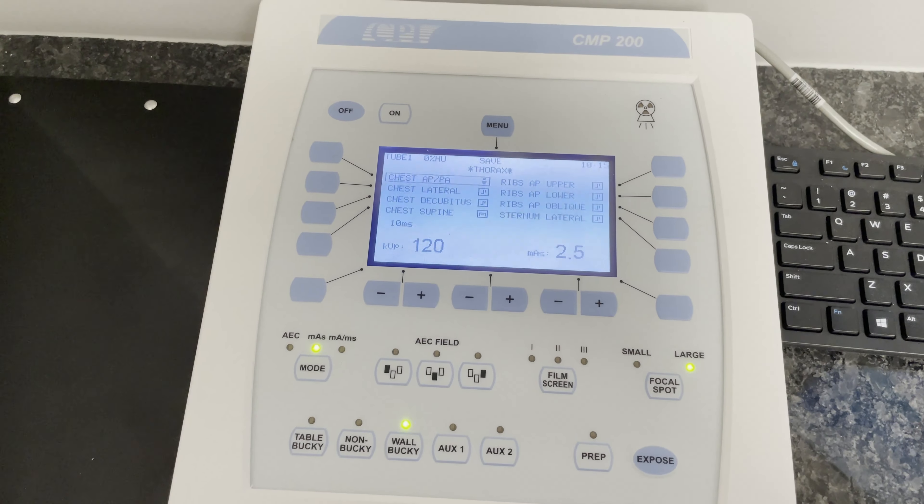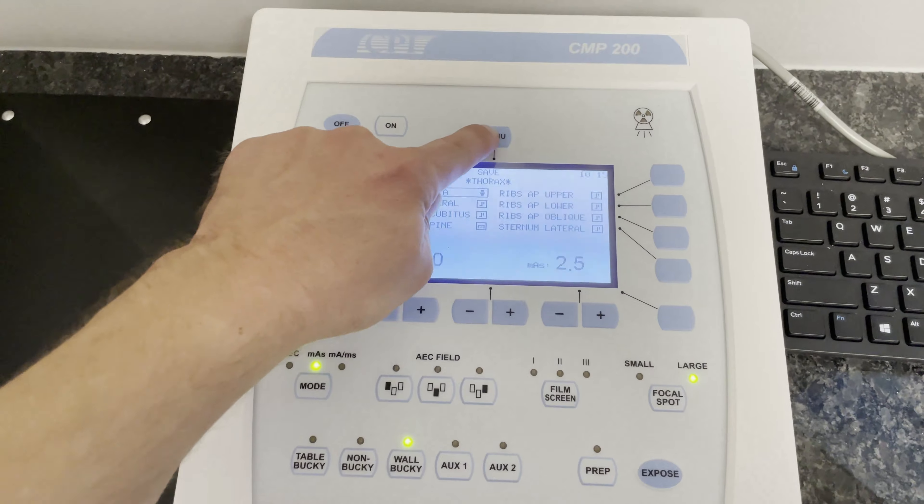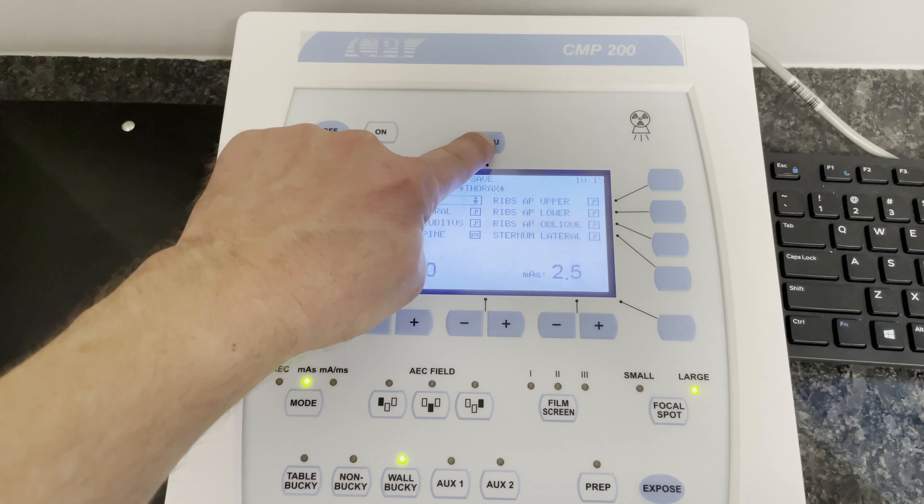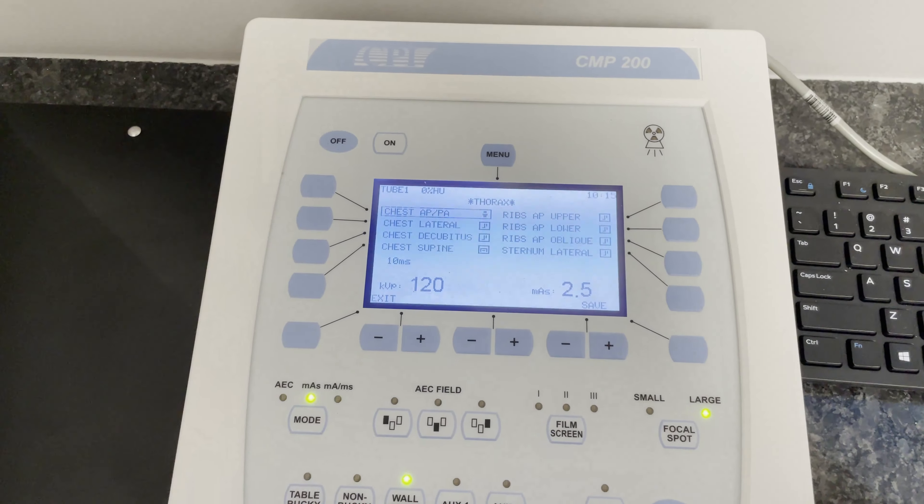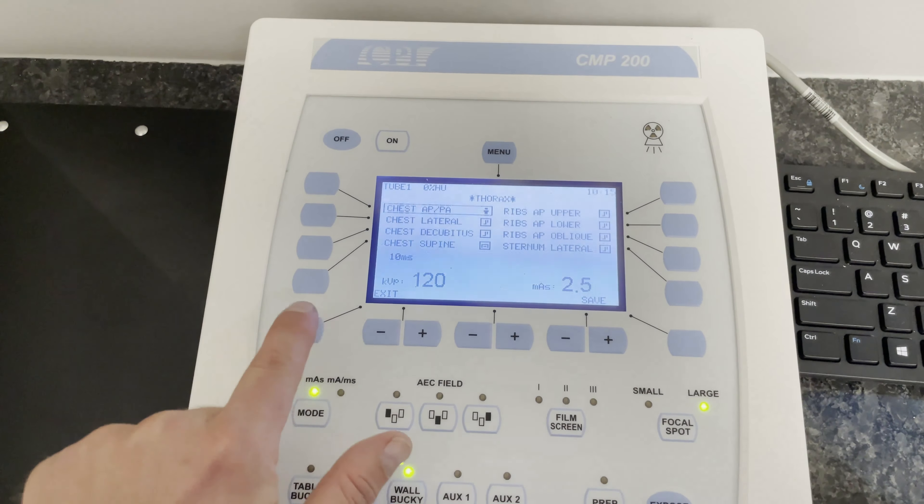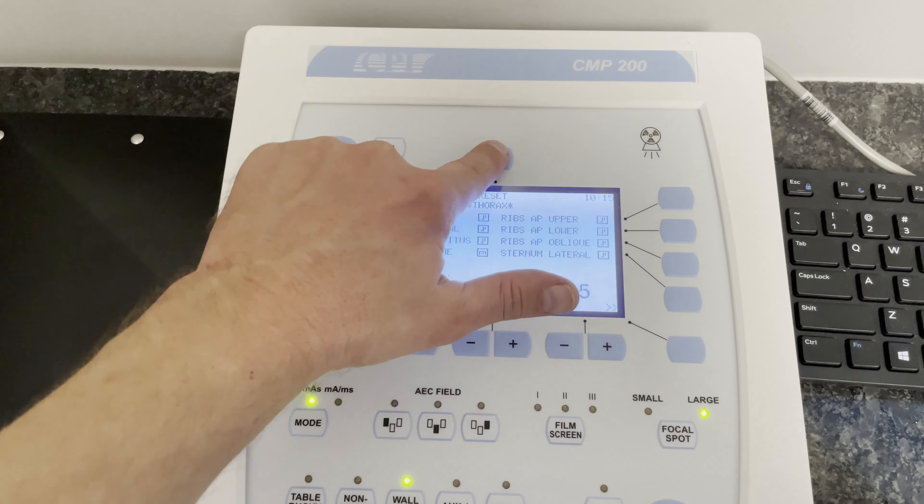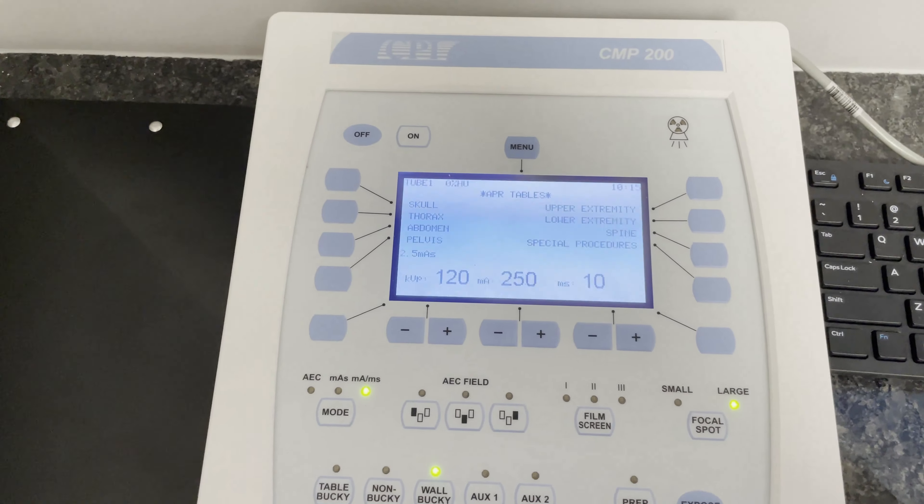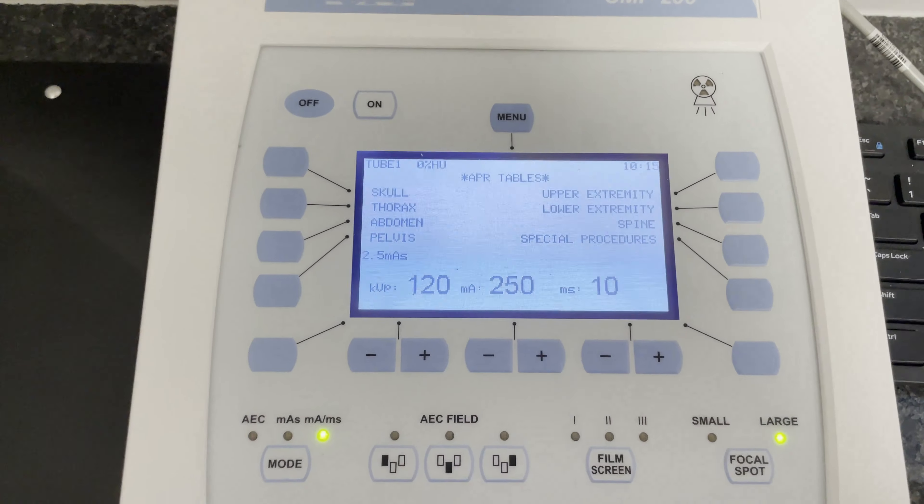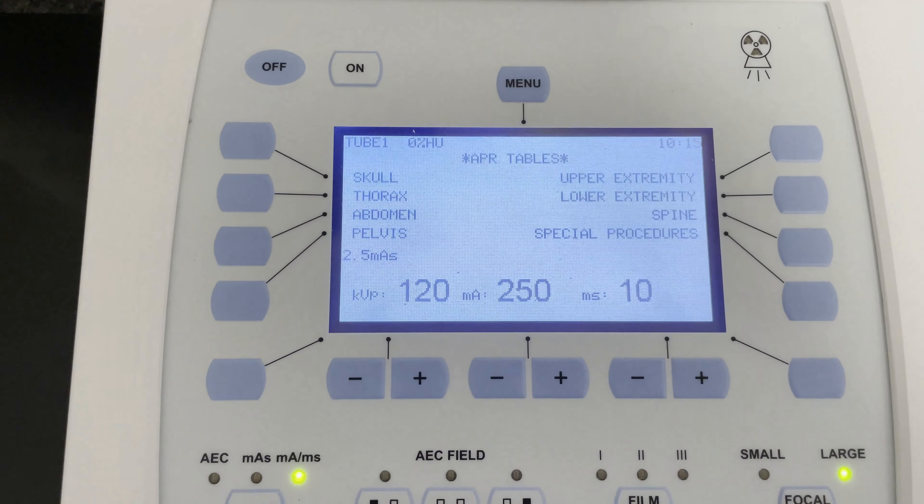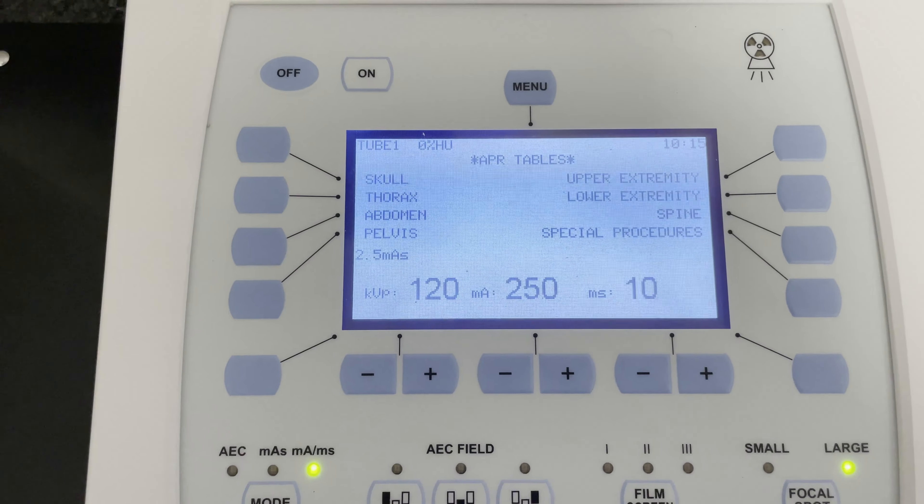Now to go to the next region, you would hit the exit button and then hit the menu button. The menu button is then going to take you back to where you can choose your next region.